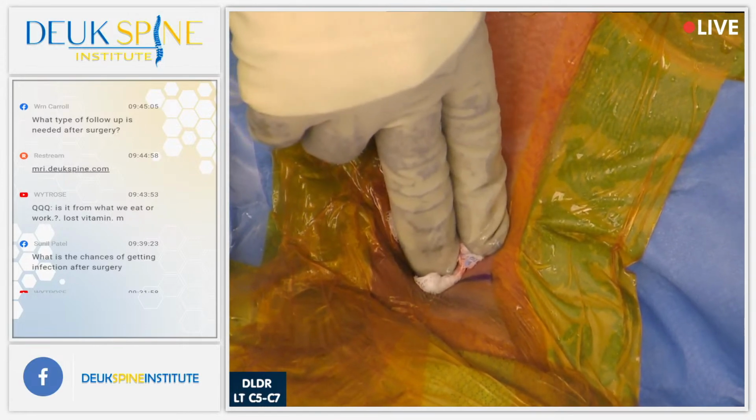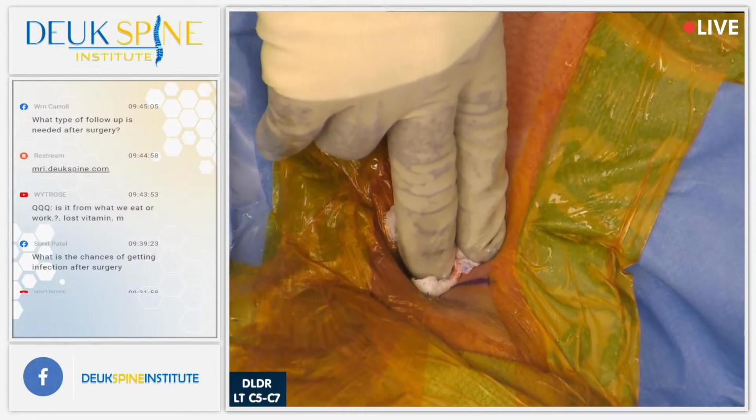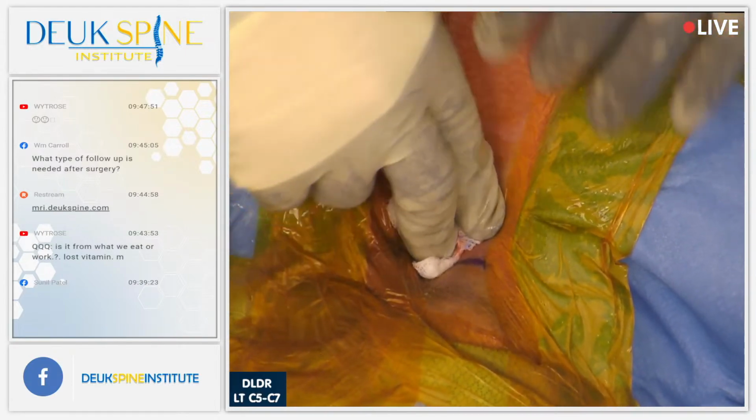One of them is blood pressure control, right? And then of course, placement of the needle in the beginning is very important. And of course, moving the dilator along the front of the spine is very important. You have to do it just right. All right, let's take a look at the incision. You ready, Henry?